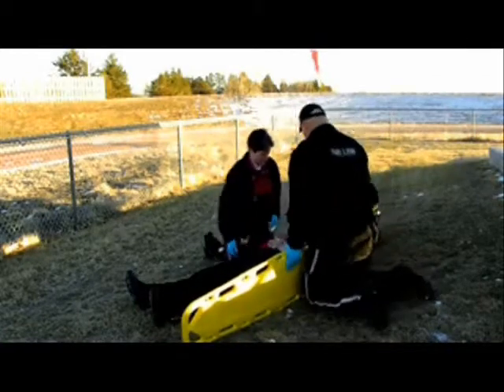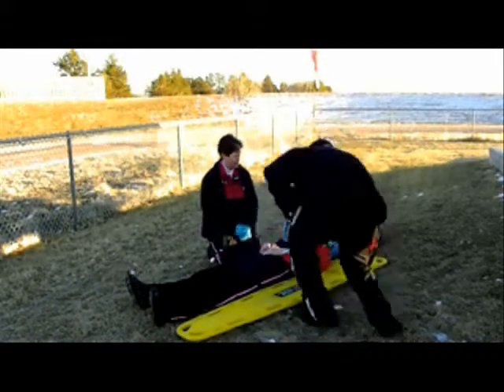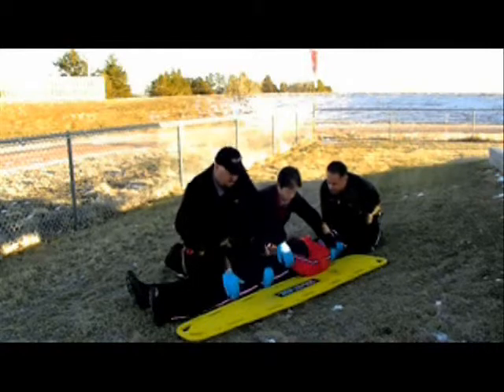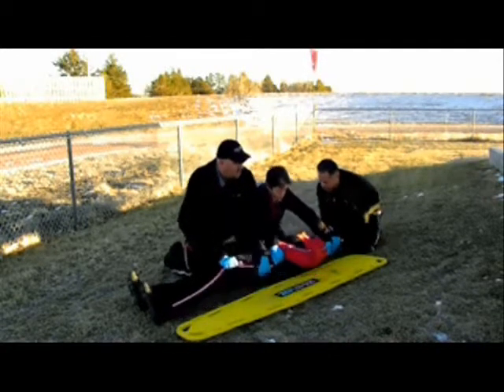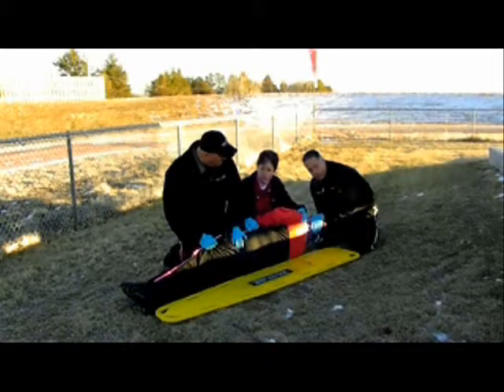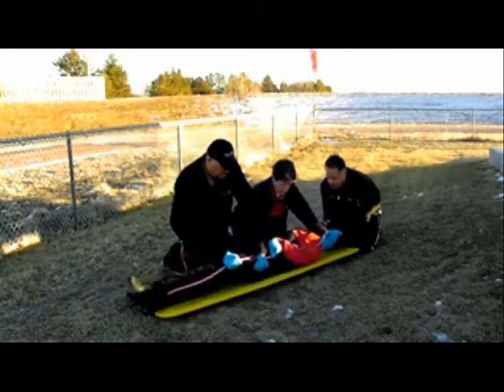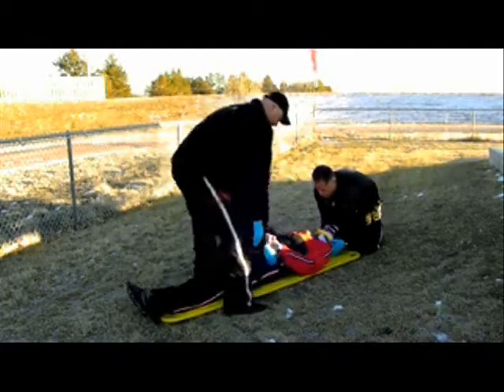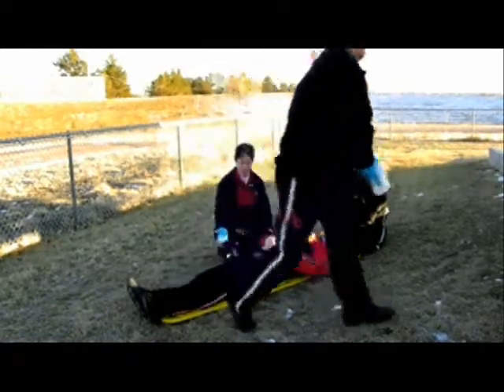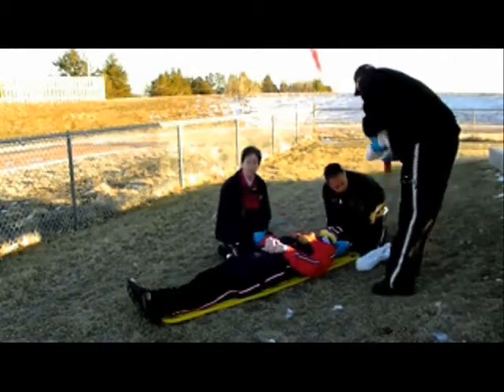Clint's going to help here. Jason's able to move so he can help us a little bit, but otherwise Sean Wilson is at the head. On my count of three — one, two, three. Padding is important in these situations. At this point we do not have enough padding, but when you do get a chance, it would be nice. On my count of three — one, two, three. And now we're going to go ahead and center him on this board with Sean's assistance. Now we have him on the backboard, and what we need to do is go ahead and immobilize the rest of his body prior to immobilizing his head anymore.